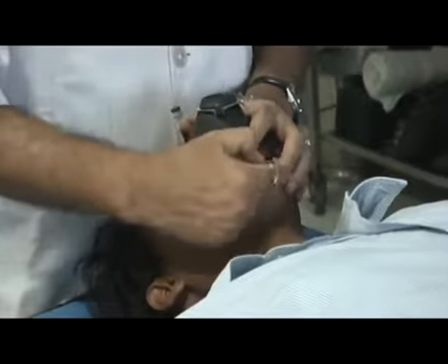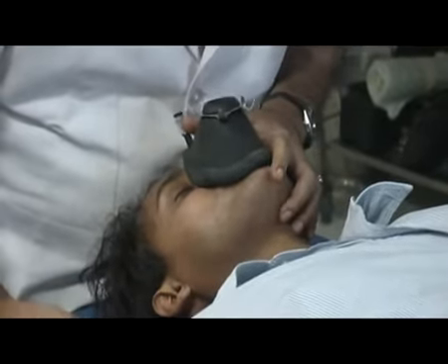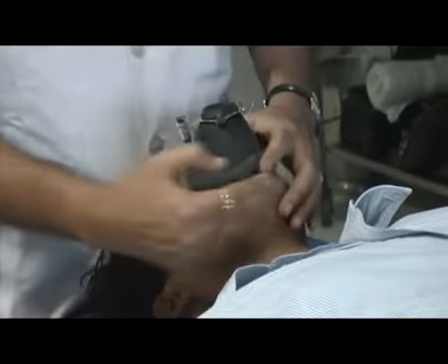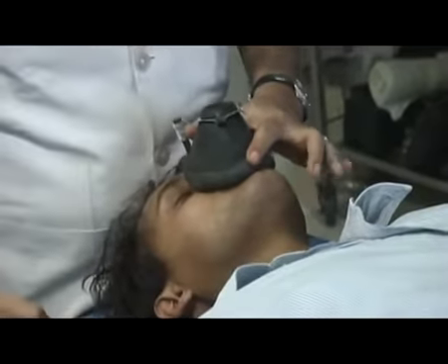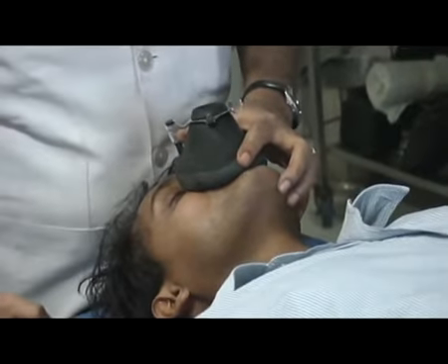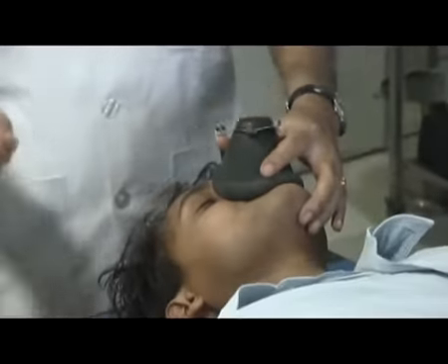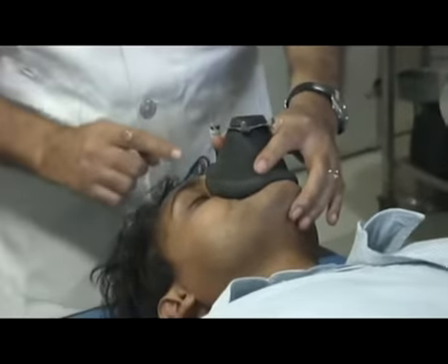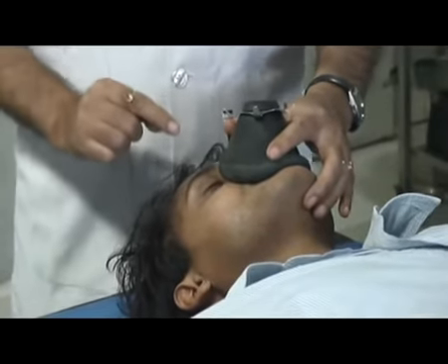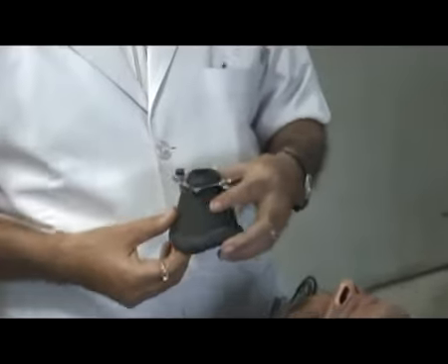These three fingers should not exert any pressure on the soft tissue of the neck or the face of the patient, as this will cause obstruction of the airway. These three fingers should always be placed on the mandible. Care should also be taken to prevent pressure on the eyes, as this can cause injury.